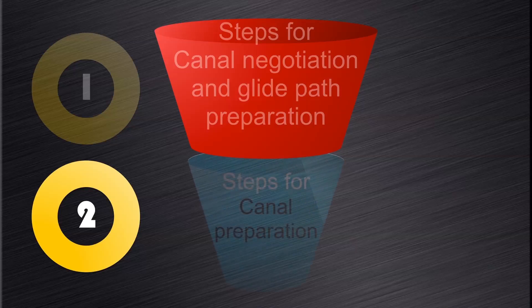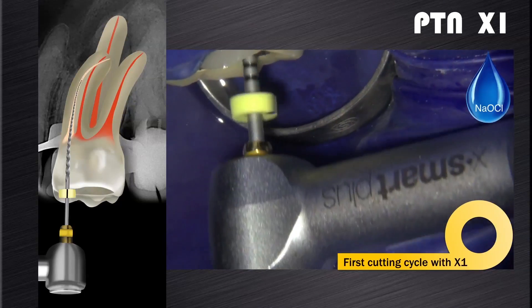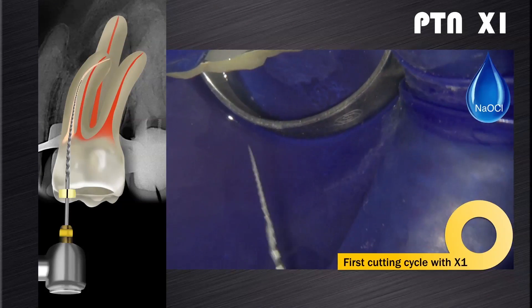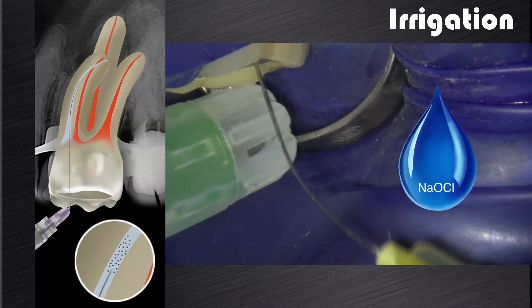The second part of the root canal preparation process is canal preparation with the ProTaperNext system. The first instrument to use after glide path preparation is the X1. In the presence of sodium hypochlorite, brush and follow along the glide path with the ProTaperNext X1 instrument in one or more passes until working length is reached. If after a few coronal insertions progress is not being made towards working length, remove the file.